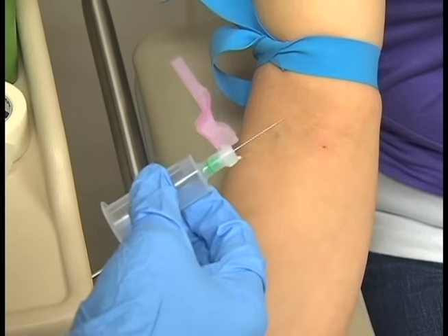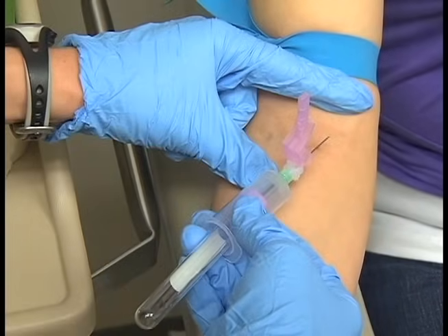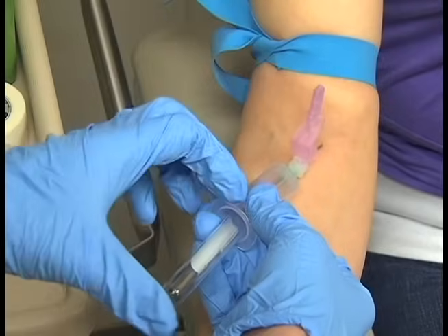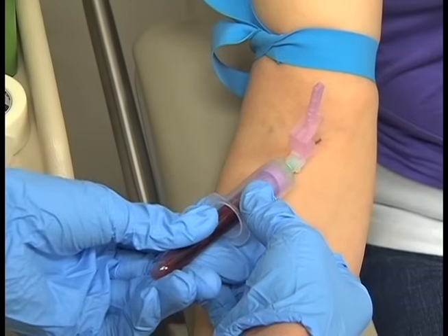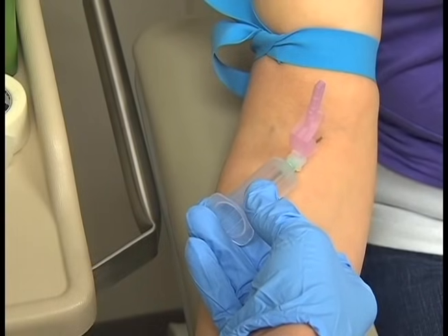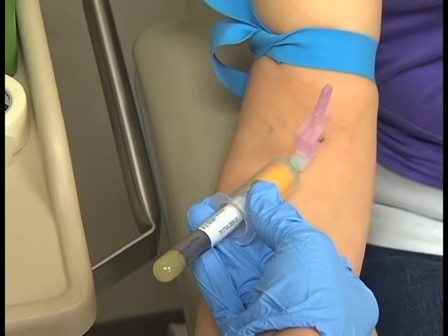Anchor the vein and inspect your needle. Position the needle at a 15-degree angle to the arm, resting the backs of the fingers on the patient's forearm. Ensure the needle points in the same direction as the vein, with the bevel pointed up. Tell the patient they will feel a small stick, then with one continuous steady motion, enter the skin and then the vein. You may feel a sensation of resistance followed by a release as the vein is entered. When the release is felt, you have entered the vein and should not advance the needle any further.